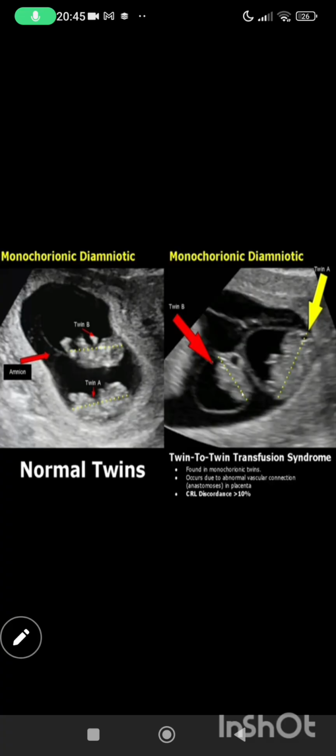Okay. In stage 3, what happens? Abnormal blood flow is detected by Doppler values, such as the artery waveforms being affected. Stage 4, hydrops, involving one or both fetuses. Which one, donor or recipient? Recipient. The recipient's heart becomes thickened and weak from extra load, so it can develop heart failure or hydrops, and we can see skin thickening and fluid in the chest or abdomen.